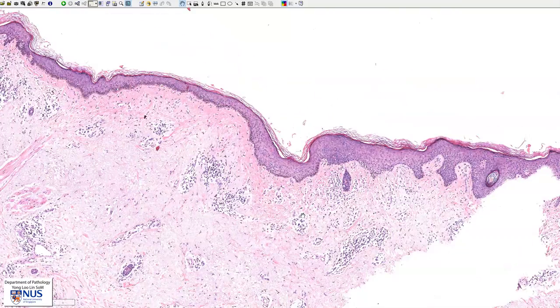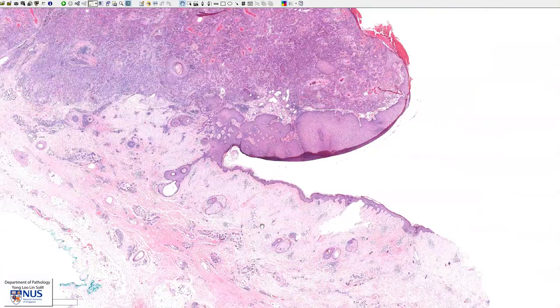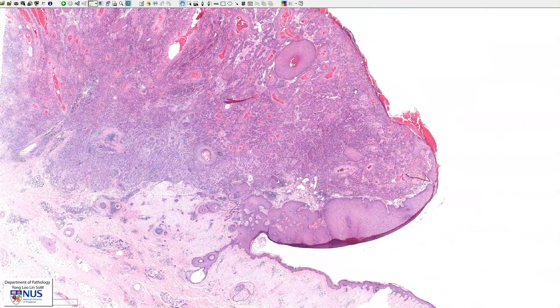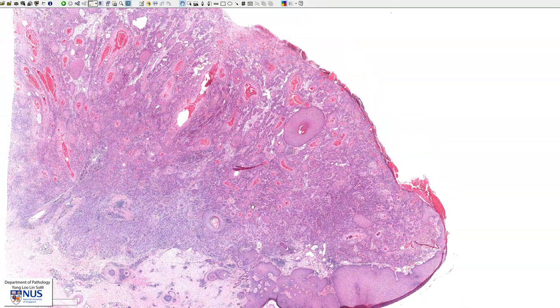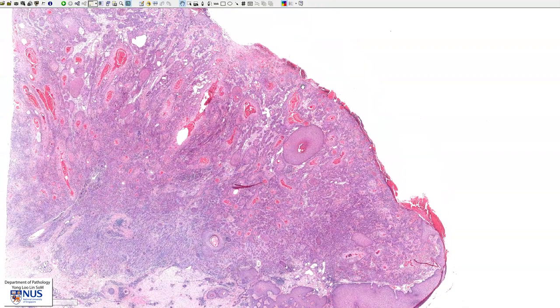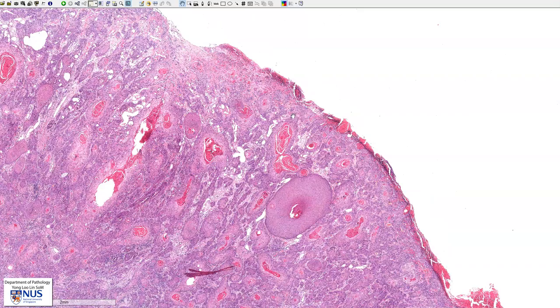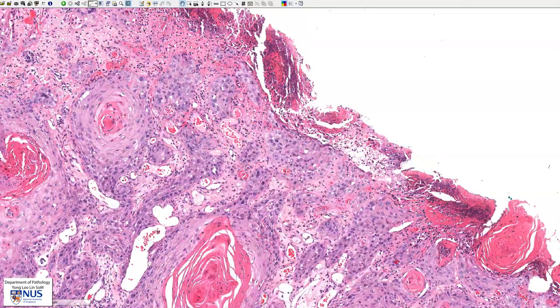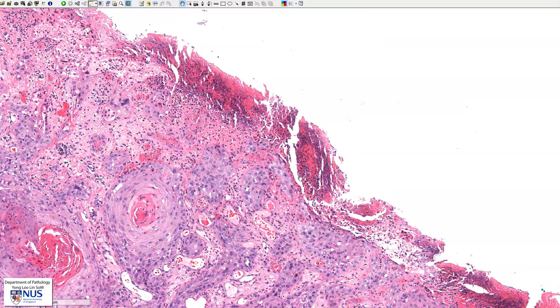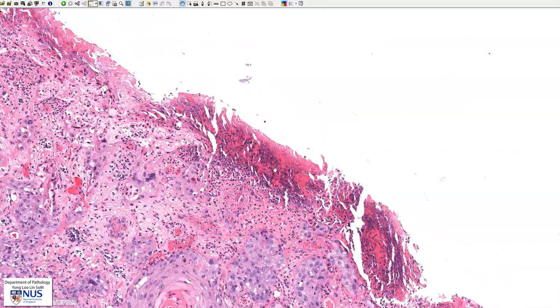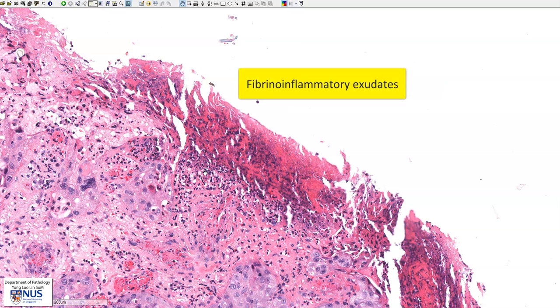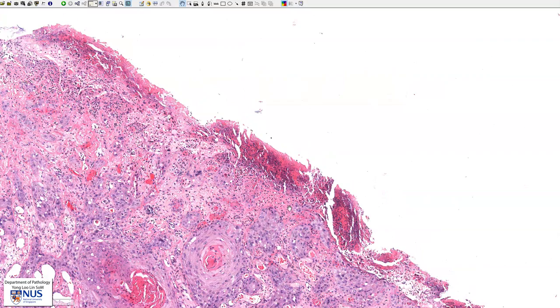Now let's have a look at the tumor. You can see that this is forming a mass, and this would be grossly visible to the naked eye on the skin. The surface of this tumor mass is eroded — we no longer have intact surface squamous epithelium. Instead, we have a lot of fibrin as well as neutrophils, so we have fibrinoinflammatory exudates and ulceration.